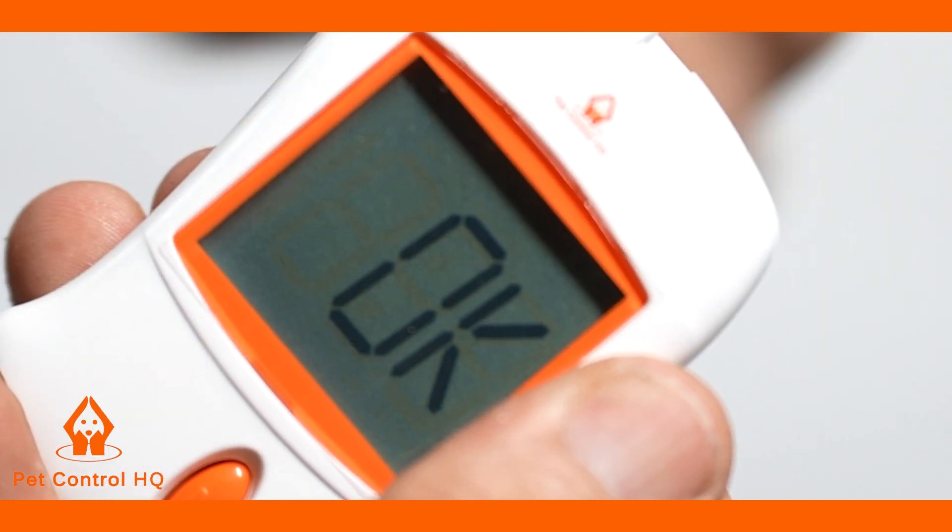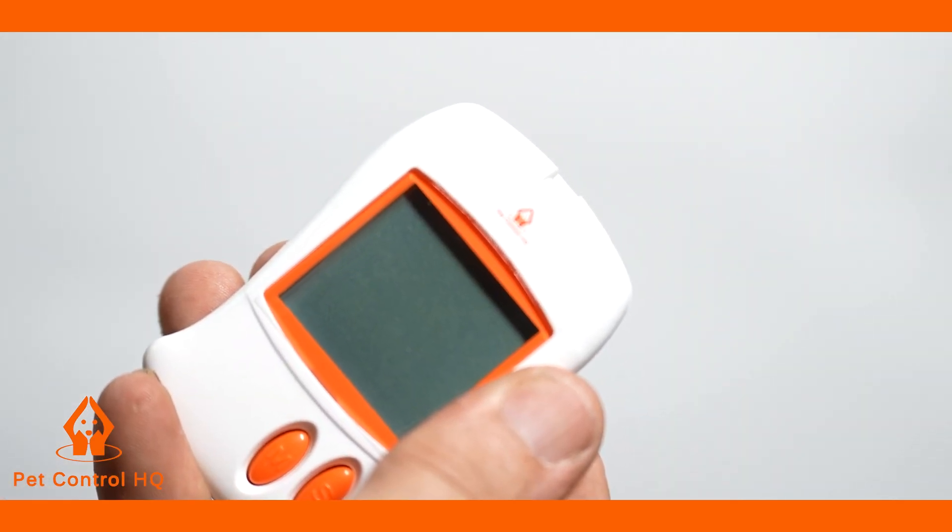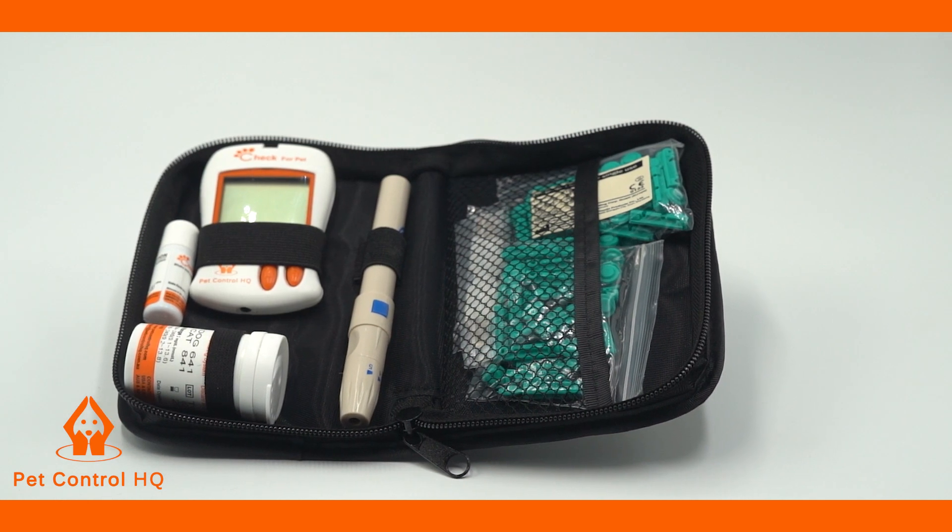The screen will display OK and turn off automatically. It means the meter has completed its self calibration, and you are now ready to begin testing and monitoring your pet's blood glucose levels.